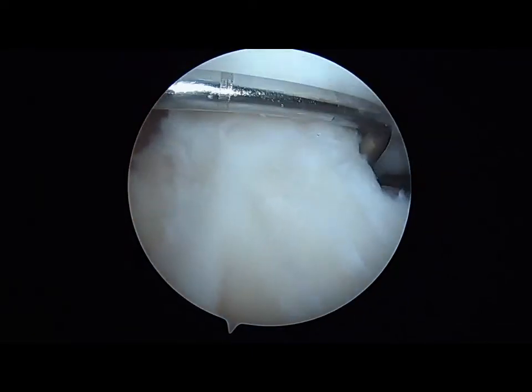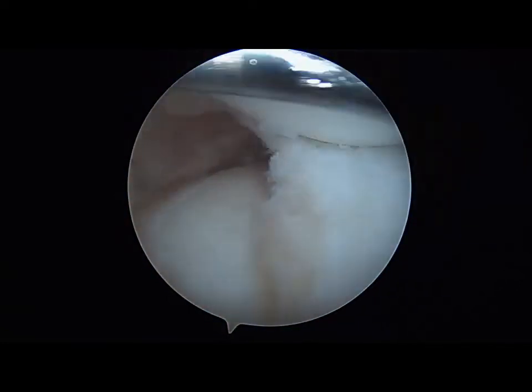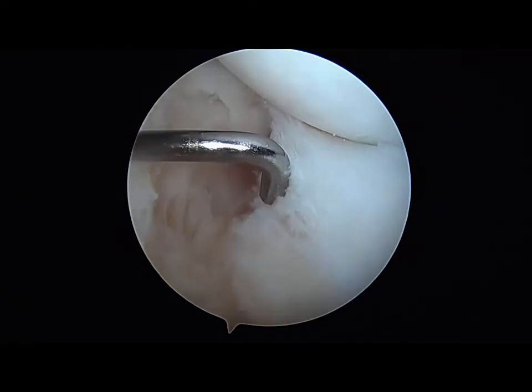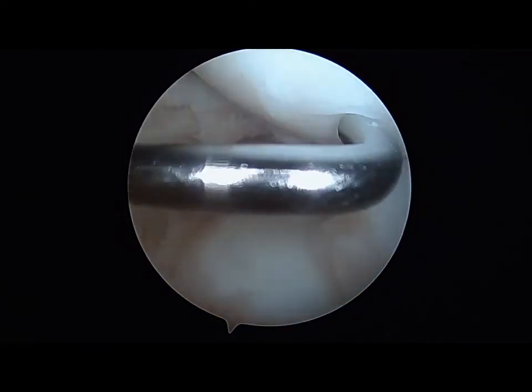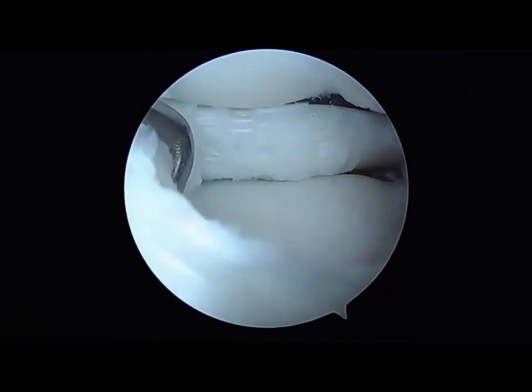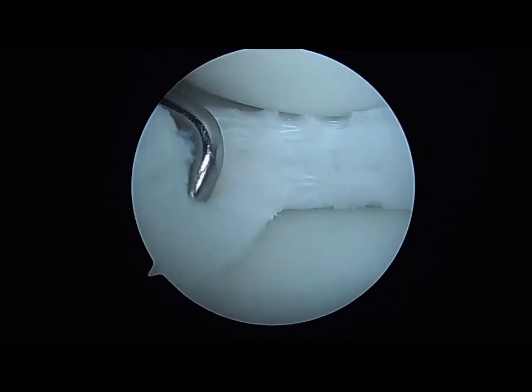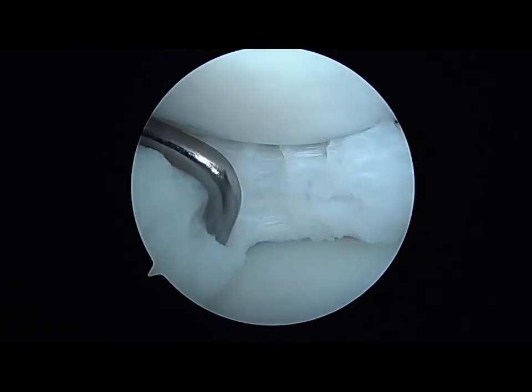After the initiation of saucerization, the arthroscope again is moved to the medial portal to view, while probing from lateral, the posterior, anterior, and lateral margins of the meniscus, further assessing meniscal stability.